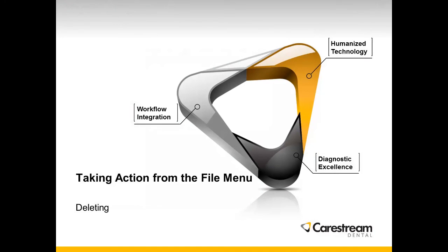Taking action from the file menu, to delete an image, follow these steps.